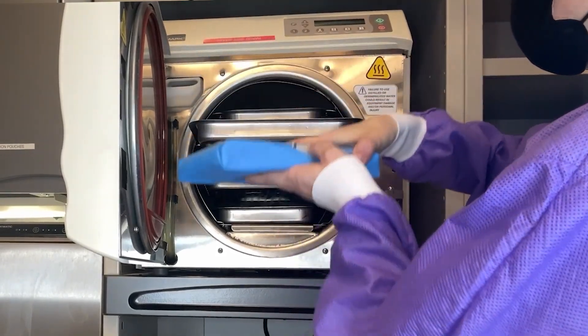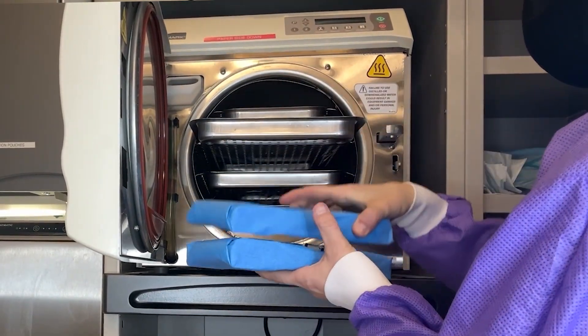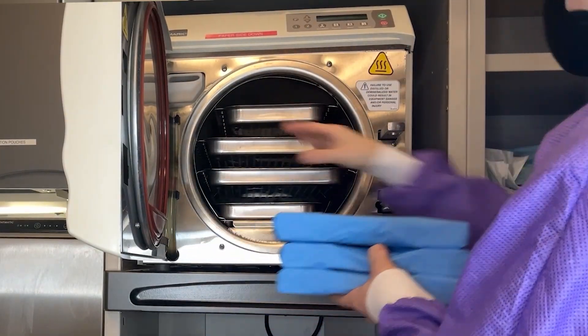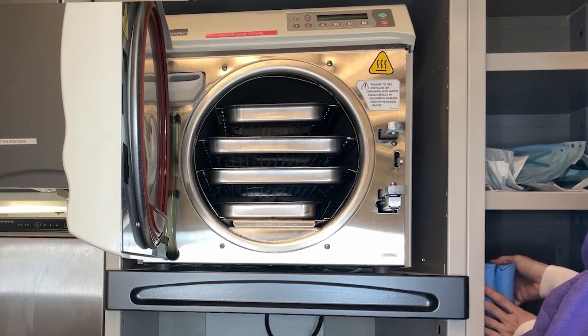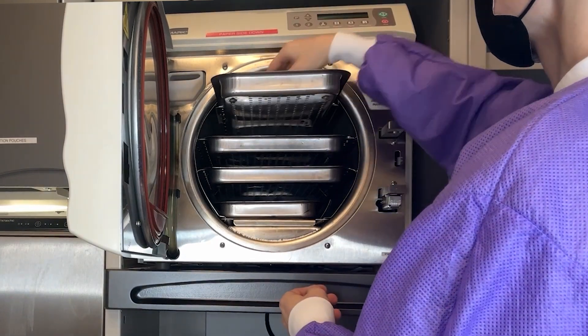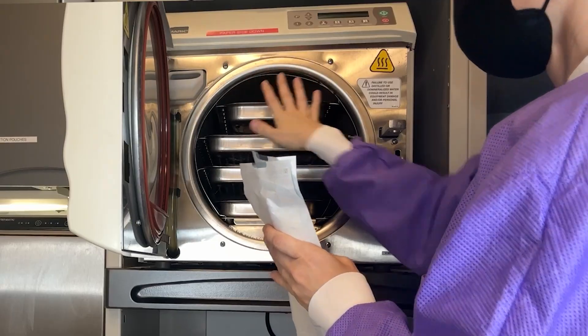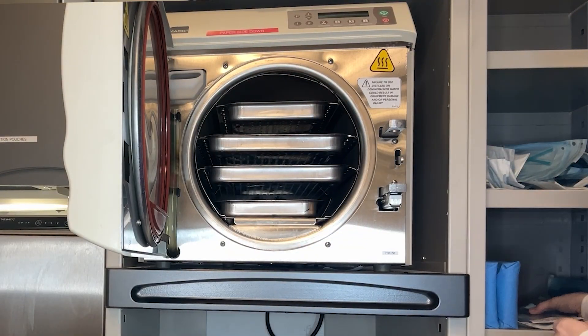After sterilization, store the instruments in a clean and dry area designated for sterile instruments. It's essential to maintain the integrity of the packaging until the instruments are ready for use, meaning handling them with clean hands or gloves and ensuring they are not exposed to contaminants or excessive moisture. Organize your sterile storage area to allow easy access and rotation of stock, following the first-in-first-out principle to ensure older packages are used before newer ones.